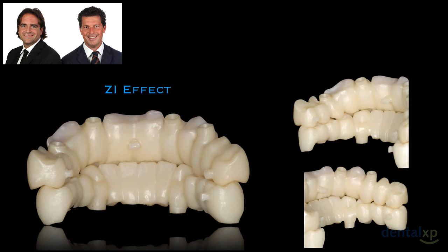Those are the frameworks that are coming out from the milling center to the dental technician lab. You can see how stable these pieces are, one on top of the others. This means that the work that Luca did on the function really worked out, because look how stable they are, just put one on top of the other and they are not moving.